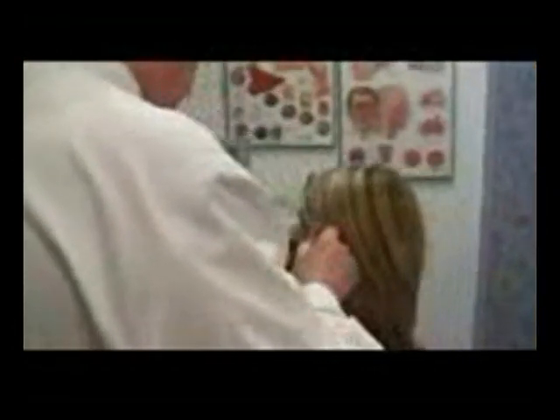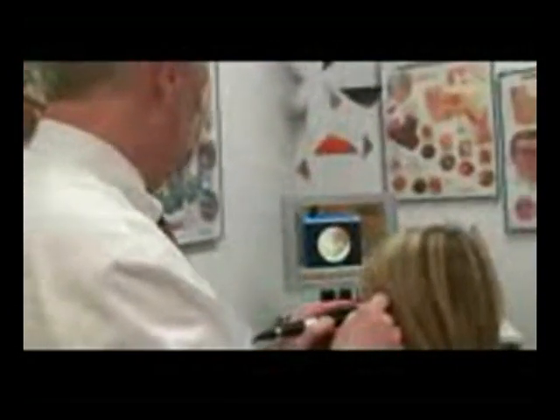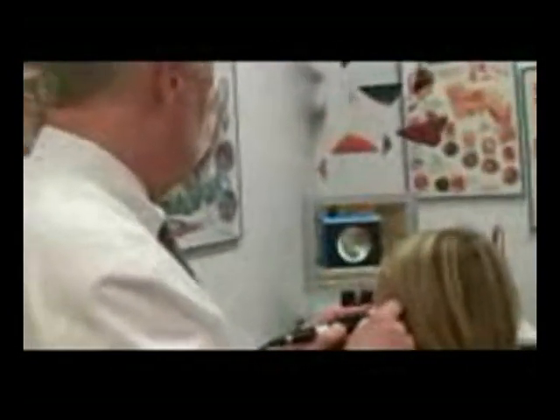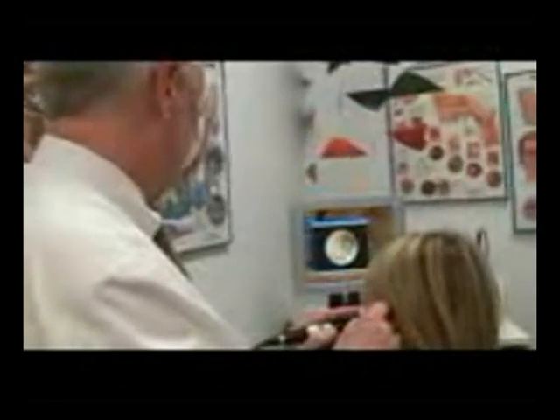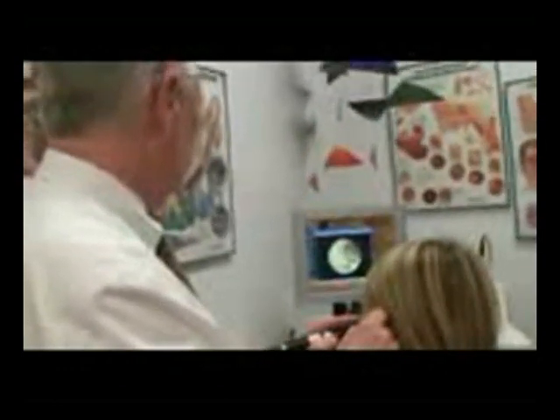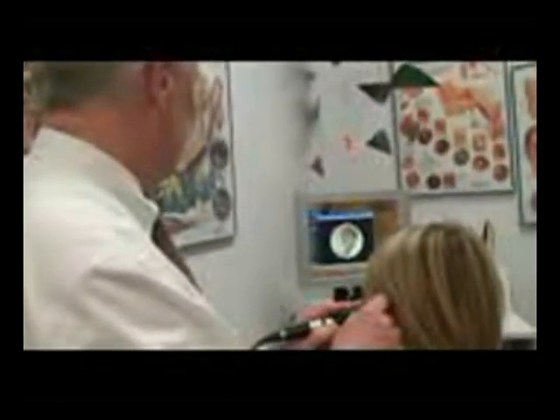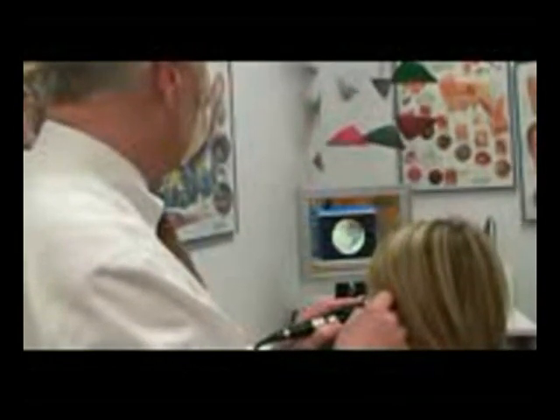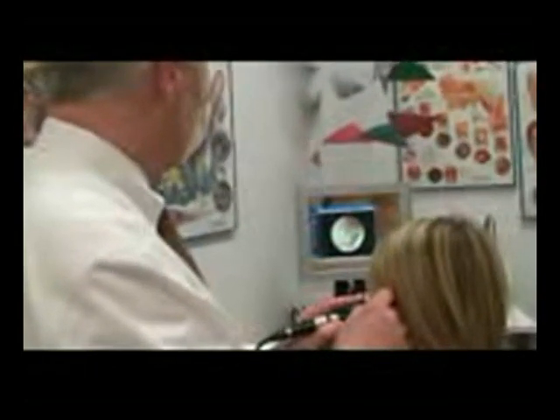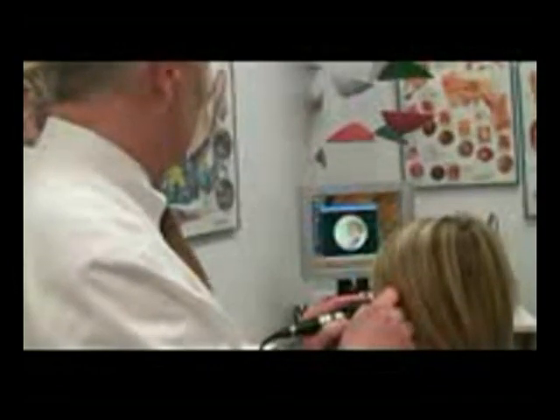We start with an audiogram. When a patient comes in for an audiogram, the hearing professional will look in the individual's ear to make sure that there's no debris or blockage in the ear. They'll also ask several questions like, do you have any dizziness, any rapid hearing loss? They might even ask what medications you're taking.